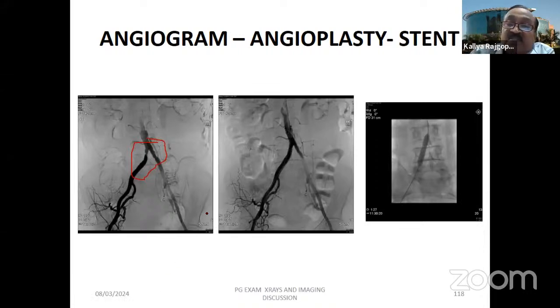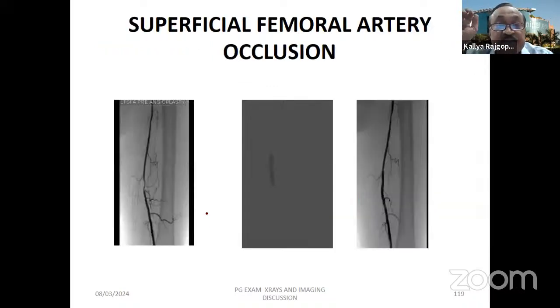Once the diagnosis is done, irrespective of the level of the arterial occlusion, there may not be an excellent result for small vessel disease, especially in a diabetic. But remember, the ulcer may heal better. That is the reason why even 3 millimeter, 4 millimeter arteries can be dilated. So angiogram is a must. To know also the distal flow, collaterals, distal runoff, it will give an excellent picture overall. So this is the peripheral angiogram.